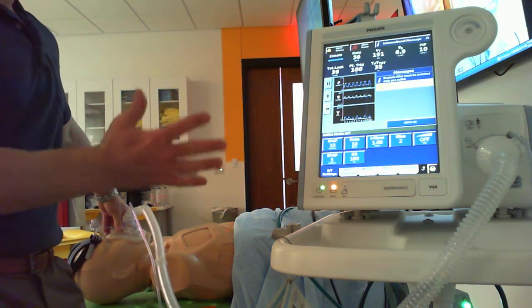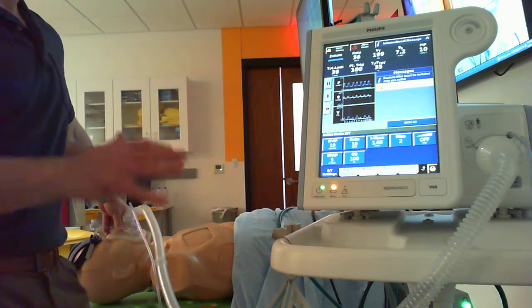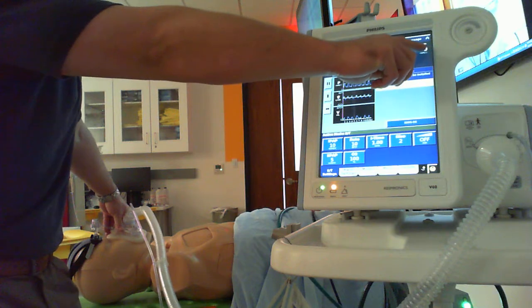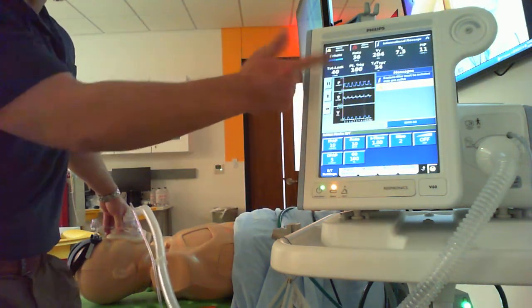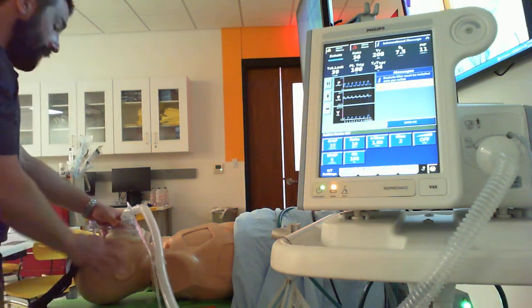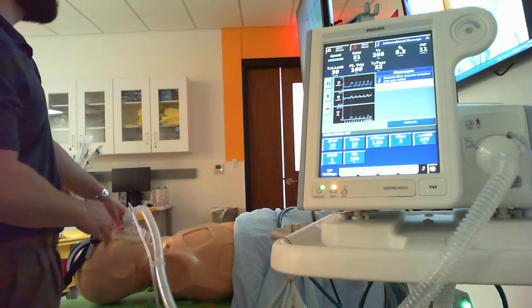Okay, I'm looking at leak. Ideally, if we can get a leak 20 to 30, that's great. As I start getting up above 60, I get concerned about that. And likewise, I want to make sure I'm able to reach my peak inspiratory pressure that's set, which we are right now. I'll further refine this leak here in a minute. Okay, we do want some sort of a leak. If you have zero leak, you got that strap too tight, and we're going to have some problems here.